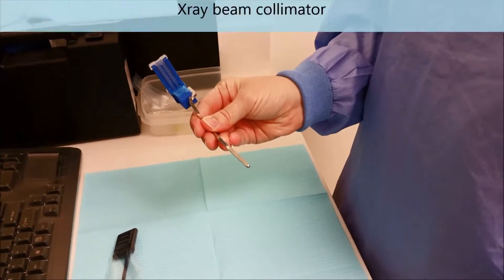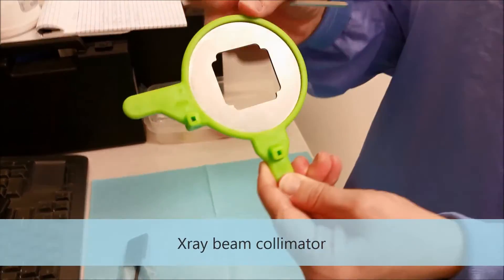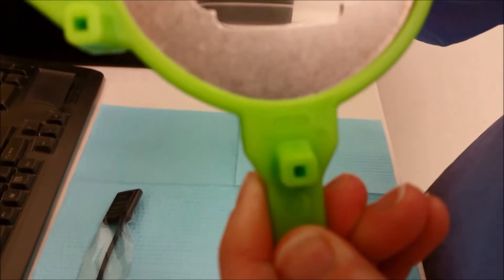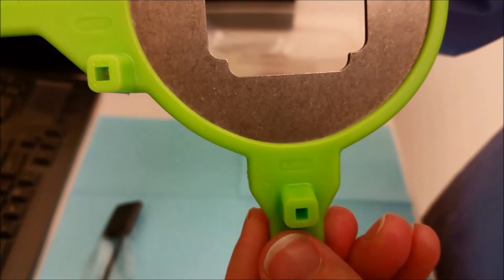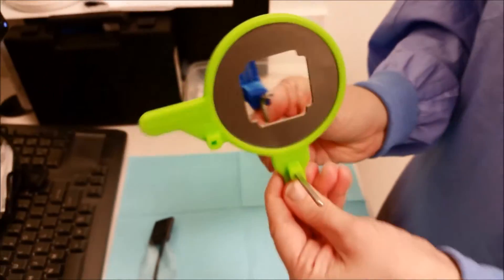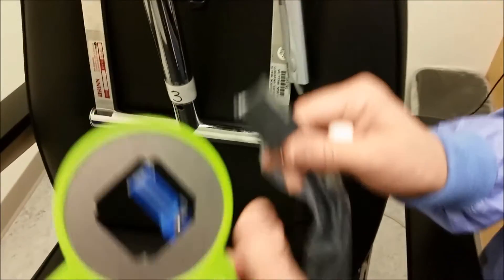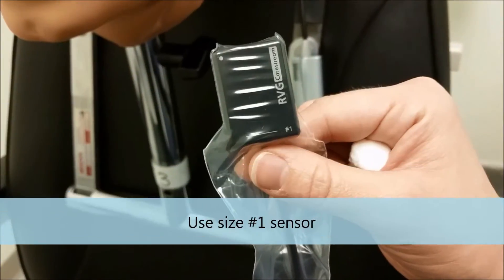So we've got that set up. Now with our JADRAD, there is a little writing on it. This is A/BW and we just use this for the A — the anterior. We do not use the JADRAD for the bite wings. For anteriors, we're actually using the size 1 sensor, which is the smaller sensor.